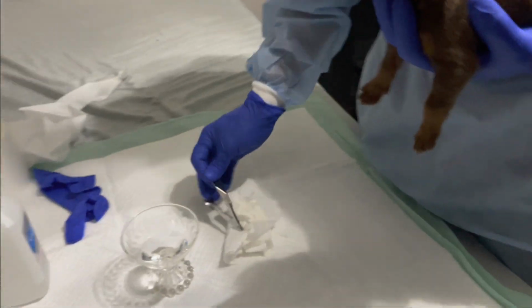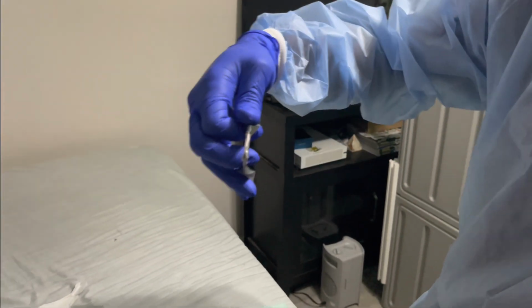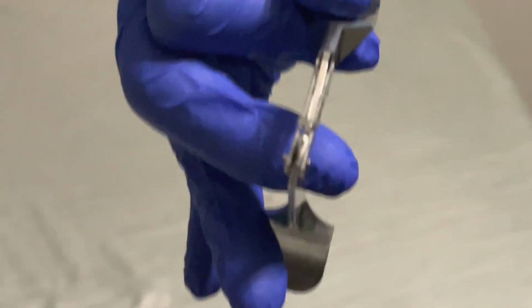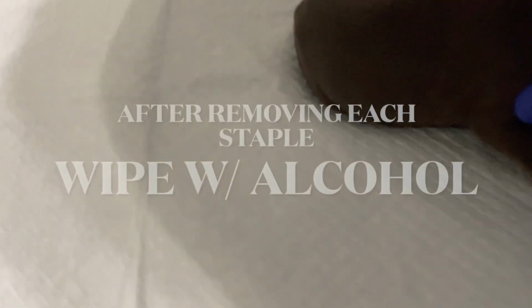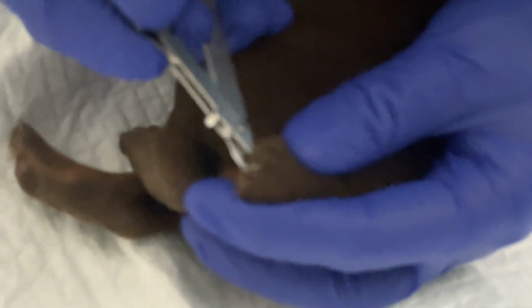I'm gonna take this. It has 3, zoom in on it. You want the top to be up. As you see, you're scooping from the 2 on the bottom. Probably gonna be hard to get it on film like that, but hold them over, and go under it.